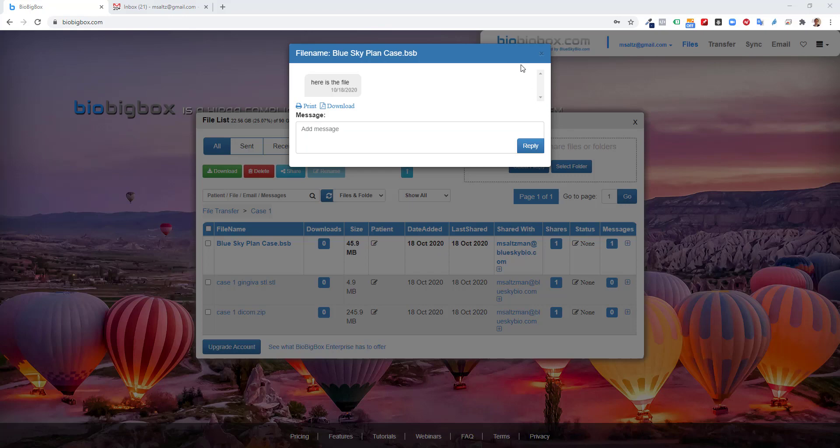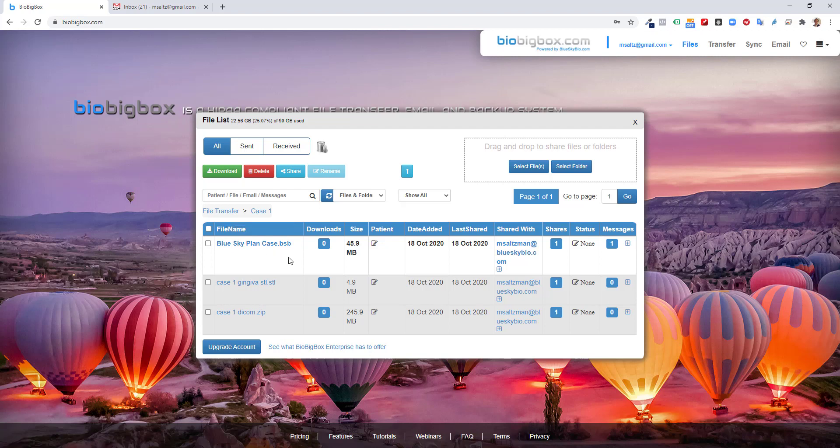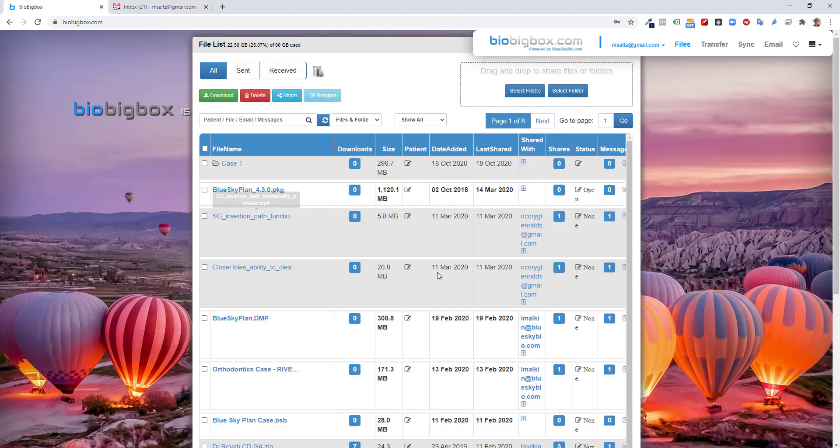BioBigBox supports any digital files, not just STL or DICOM or BSP files. So if there's any other additional files, whether they're images of the patient, whether they're video describing the treatment plan, they could all be transferred and stored within BioBigBox. They could be put into the relevant folder, and everything could be kept very organized and structured.